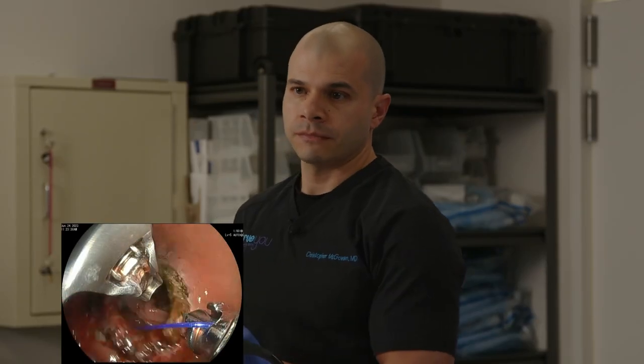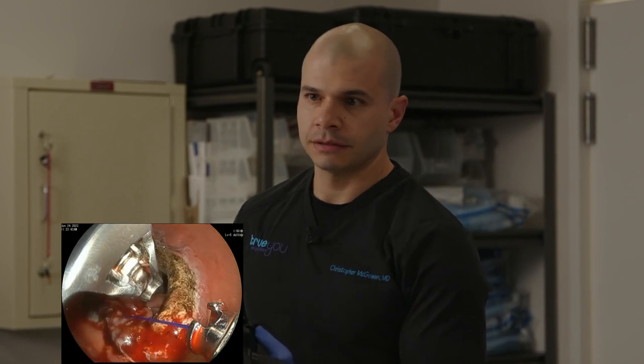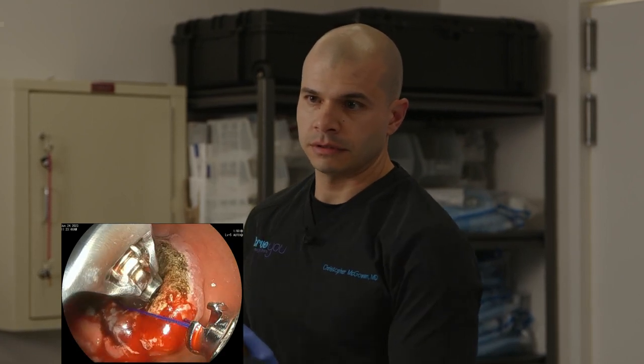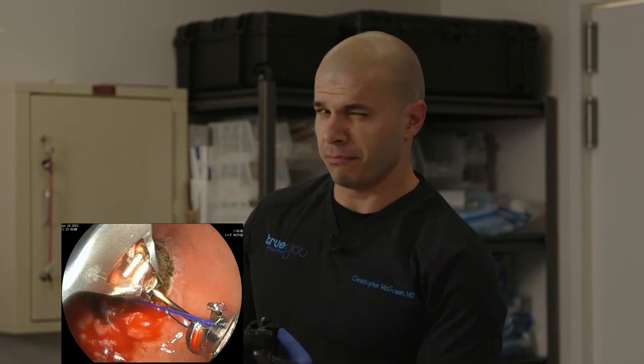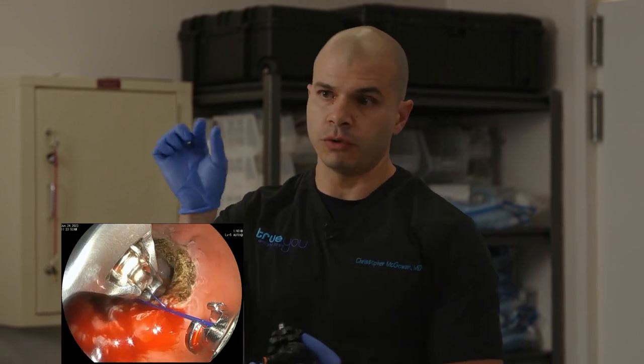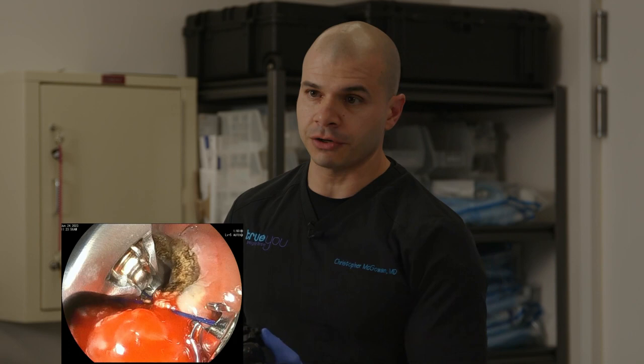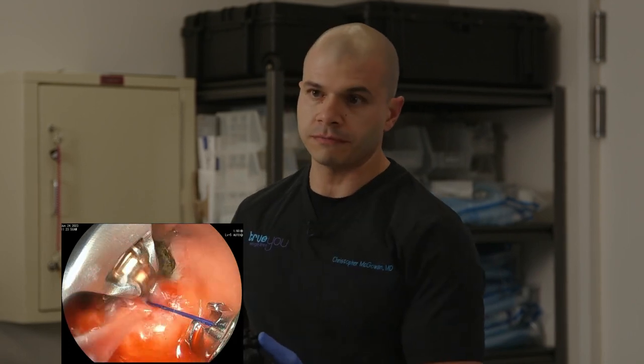Got a couple of technical questions from LinkedIn. This is from Dr. Fernandez. What is the extension of the APC area? What is the extension? I'm guessing that refers to the treatment around the outlet, perhaps. Generally, about a 1 centimeter margin. I think that's what that means. If you want to clarify that question, I can answer more specifically.